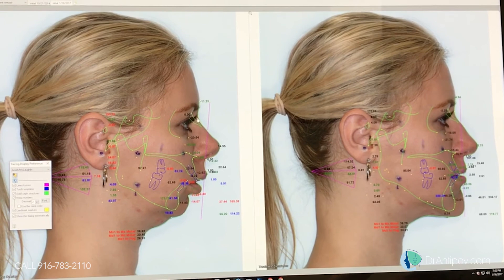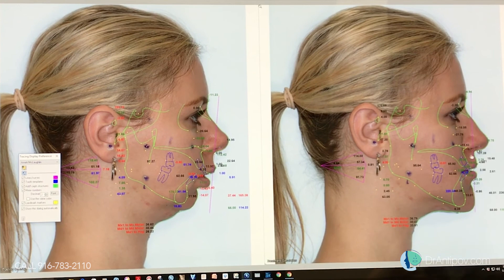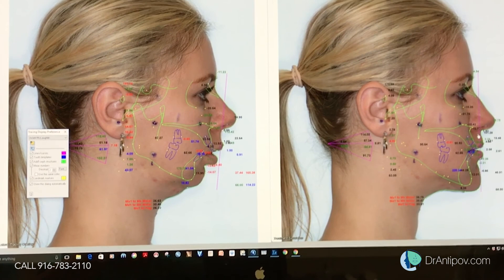The nose projection is good, but it's short, so we need to lengthen it. It will help with the lip length as well. We'll bring the nasal base down by grinding the bone up here, and the nasal base will move down to this area as well, so the lip will appear shorter.